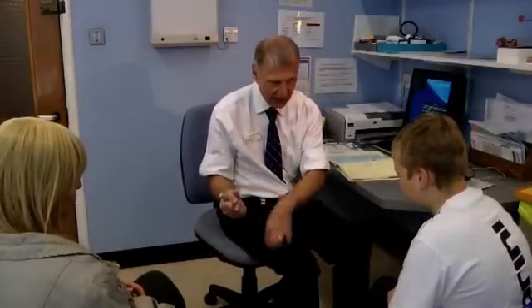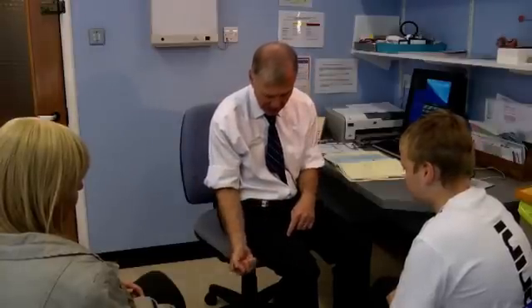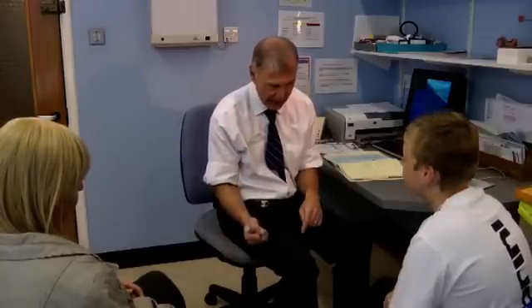The place we're going to want to inject the adrenaline is in the muscle on the side of the leg, because there aren't any big blood vessels there and it's a good place for it to work. It's halfway down your thigh and halfway around — so not right around here, not at the top, but halfway around at about a 45-degree angle.